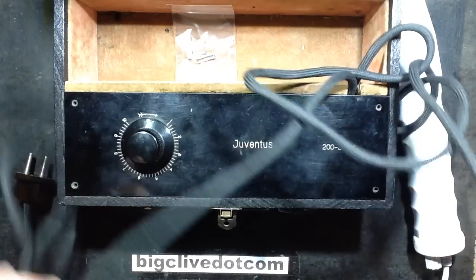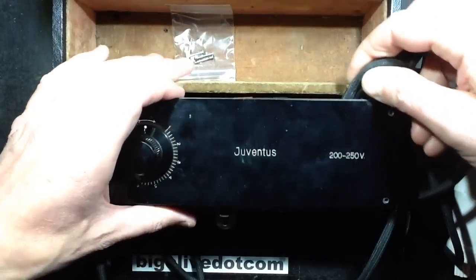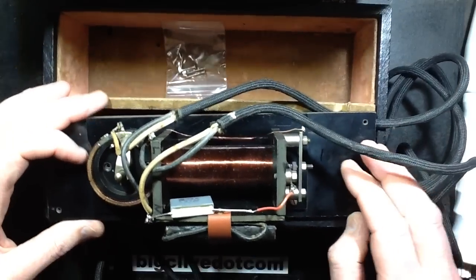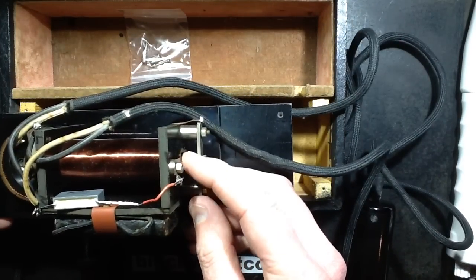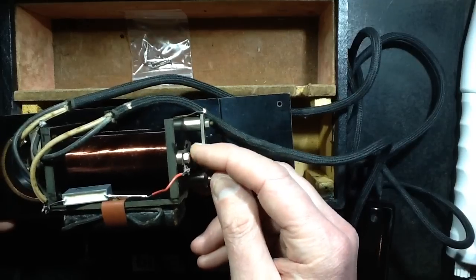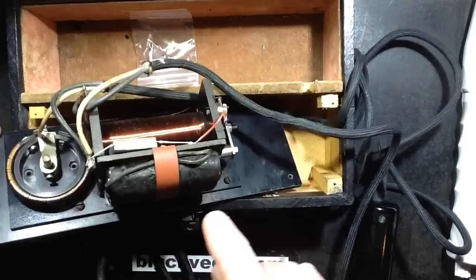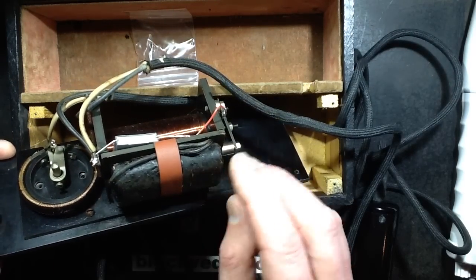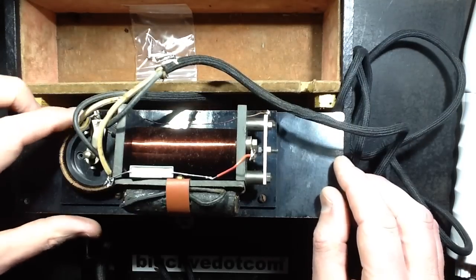And inside this unit, you'd generally find a coil with a vibrating contact at the end there, with this adjustment screw for adjusting it. A capacitor. Now, I've added this capacitor, this is a new one. This is the original capacitor. It's sort of all sealed in pitch and it's pretty yucky and it was faulty. The unit wasn't working when I got this one because of that.